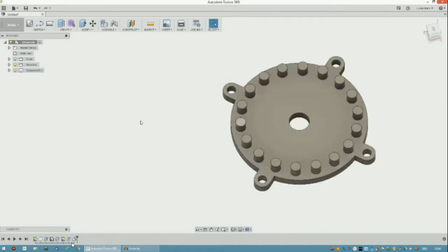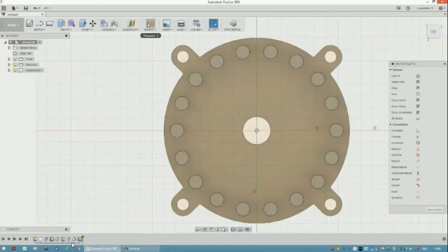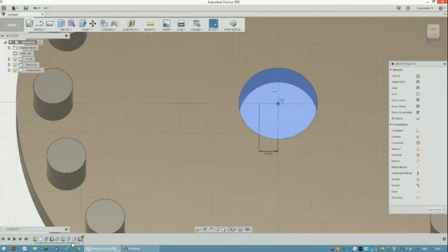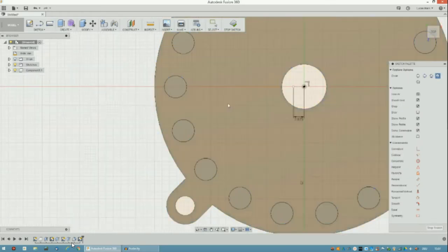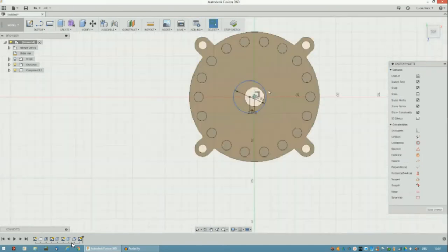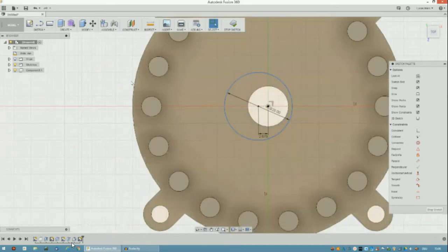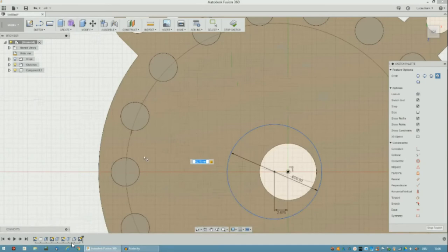And now we make our second component, the disc. And for that I just created a new sketch and made it a little offset of 2.675, I think. I found this out by tinkering around. I don't know if there's any formula. If you know it, put it into the comments, please. Now I made the circle diameter a little bit bigger. I adjusted it later on the base. And now I draw the outer circle. I found this also by doing the math at the beginning of the video.